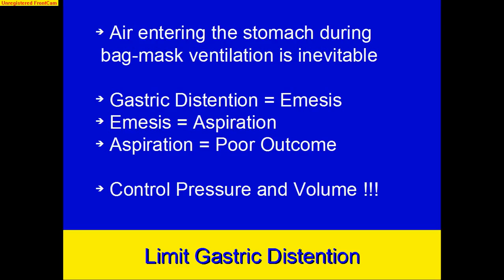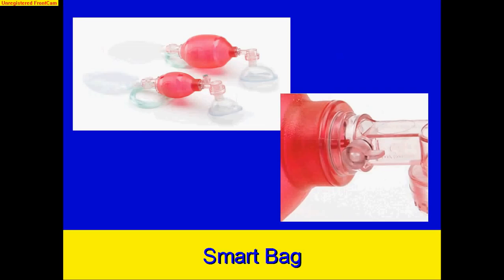So we must control our pressure, smooth, low-pressure ventilations with the correct volume. The correct volume would be enough to make the chest rise, not the entire volume of the bag valve mask or the most that we can squeeze in.